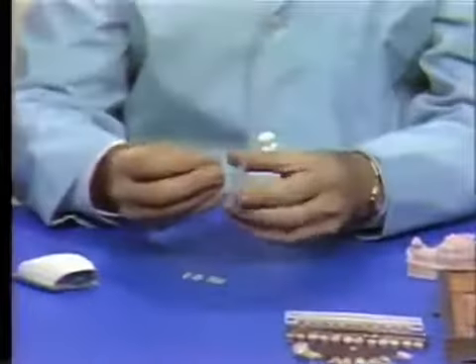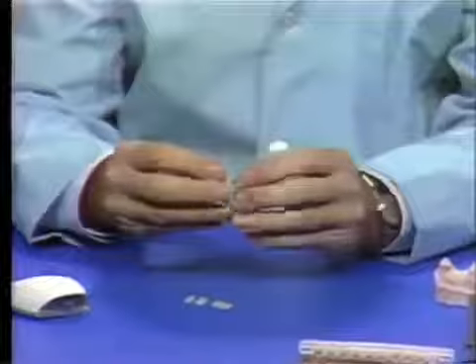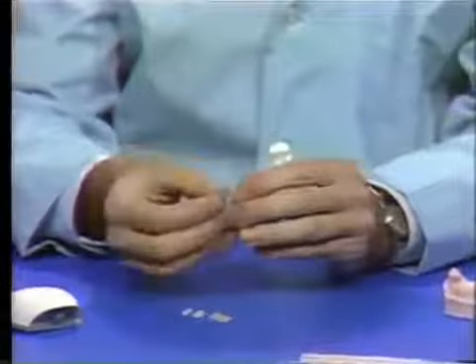Now here is an actual Steele's backing. That was an enlarged model, and this shows you the actual Steele's backing and facing, which is mounted on a little display model here. This is the precious metal backing, and there I think you can see the facing quite well. This is in a high fusing gold to which a casting can be made against that. This has, of course, to be trimmed after the facing has been cut and modified to suit the particular clinical case.